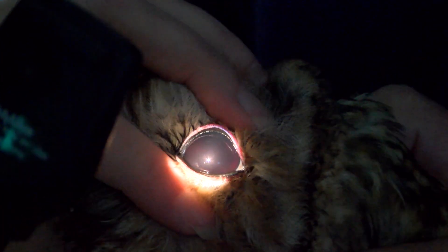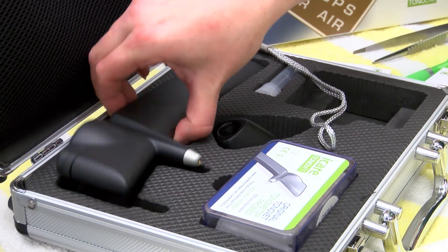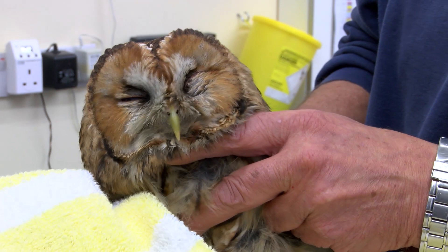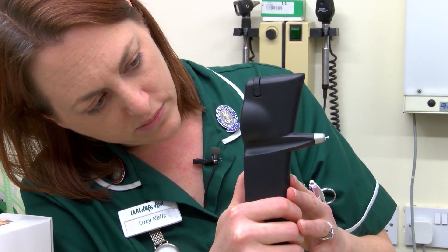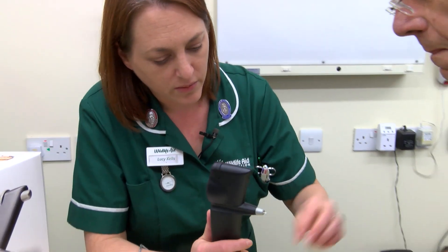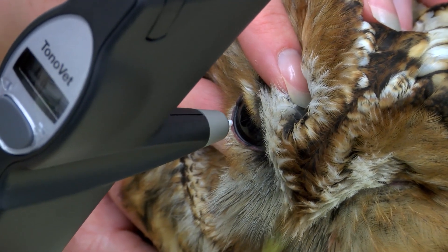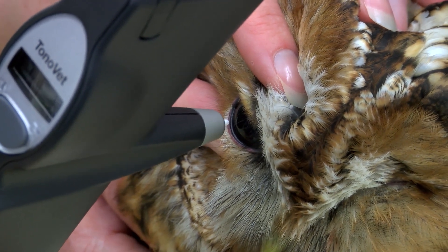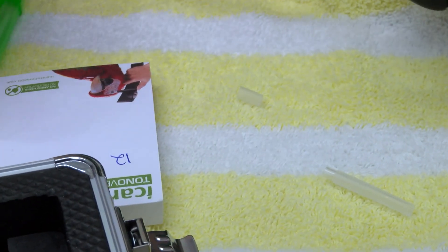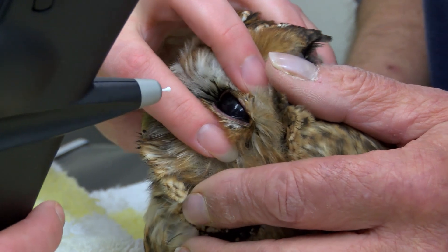So now we've done that and we've confirmed the bleed in his eye, now we can test the pressures. You don't want to do the bad eye first — I'll probably do the good eye first to start with. The good eye reads 12. Alright, so the good eye is normal, so now I just need to check the bad eye. It's important to have the head as straight as I can, and then just open the eye.